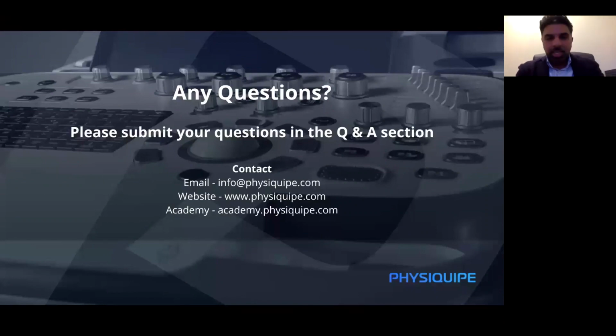Absolutely. It's funny actually, because I did a big literature search, and we were supposed to publish this. I think what we found is that guided injections provide more accuracy. In terms of long-term outcomes, maybe it's not shown to give any improvement, but it definitely does improve accuracy.